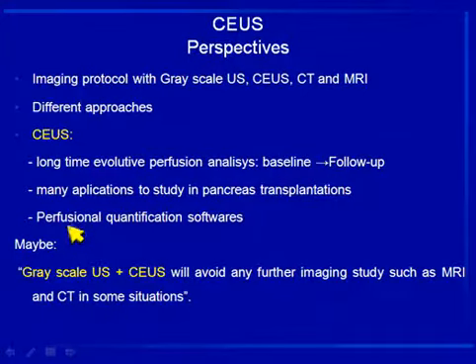Now, some perfusional quantification softwares are available for evaluation of the pancreas graft, and maybe grayscale ultrasound with contrast-enhanced ultrasound will avoid any further imaging studies such as MRI and CT in some situations.